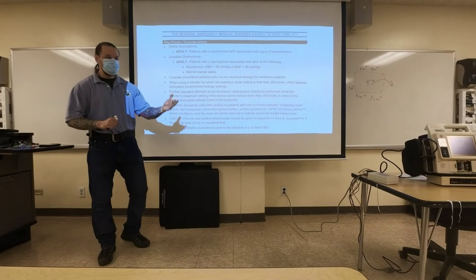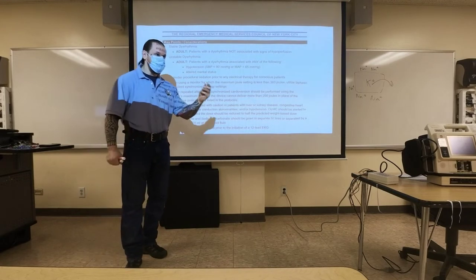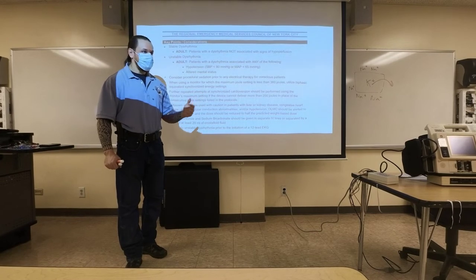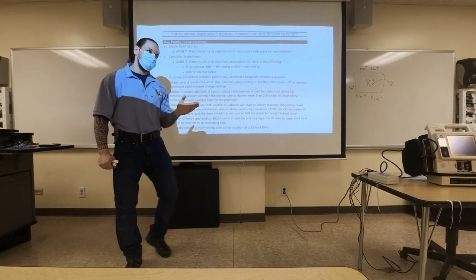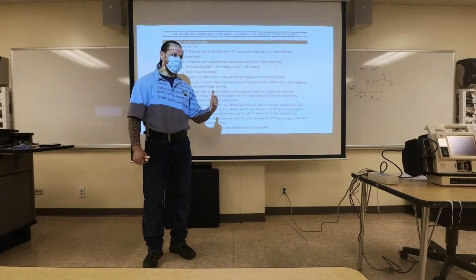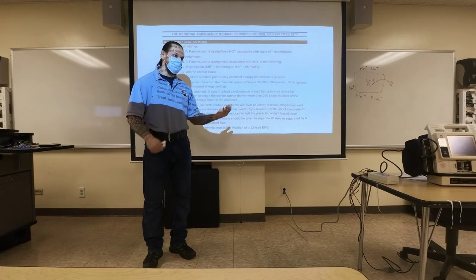Why? Because let's say you put someone on the monitor, right? And you see wide complex tachycardia, right? And the rate is 200, right? The thought process was if you were to do a 12-lead EKG, it will extend the time before you could correct them. And the longer it goes, they may go into a pulseless condition, right?